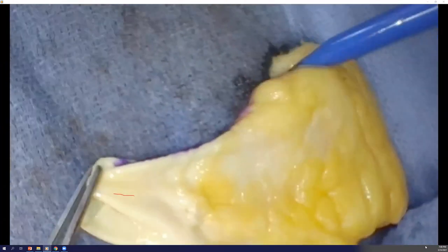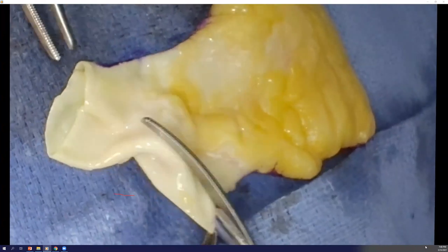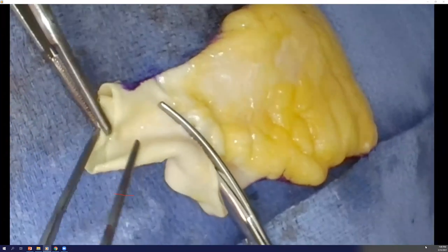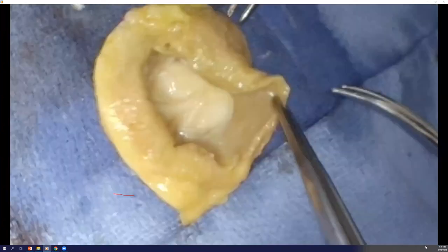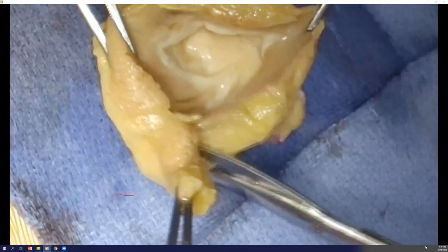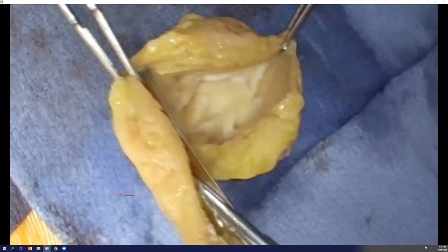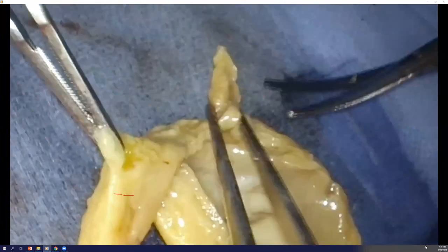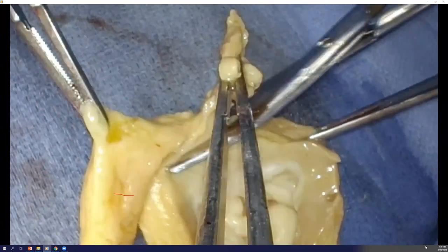This is a decellularized pulmonary homograft. So you transect it distally, just proximal to the bifurcation. And we trim the muscle proximally, the infundibular muscle. I like to trim it to leave as little as needed of it to just suture it in position. These are cryopreserved homografts, so we always have them in the freezer. They're readily available. And then we start with the distal suture line, followed by the proximal suture line, which I think is an easier sequence than the other way around.